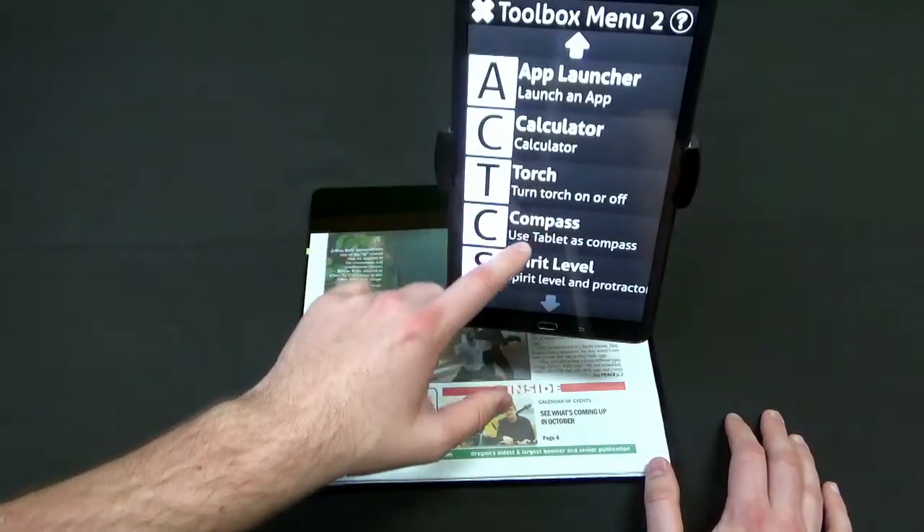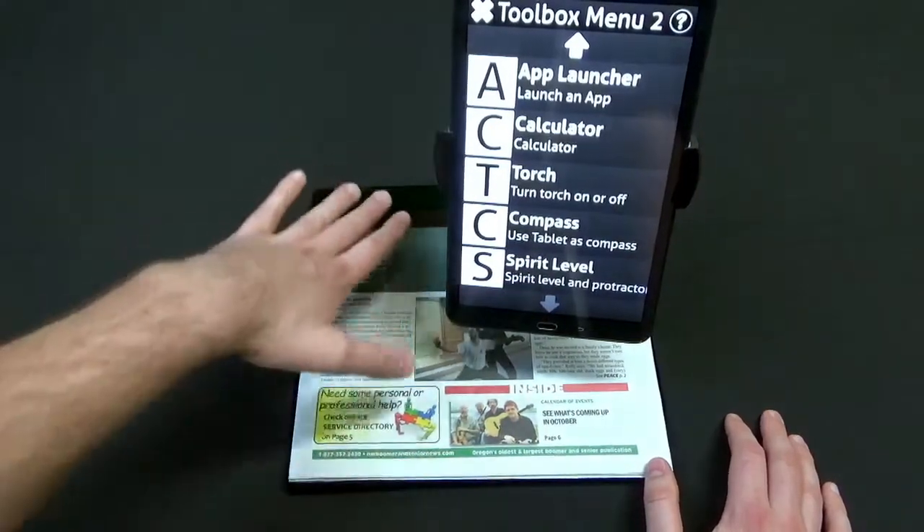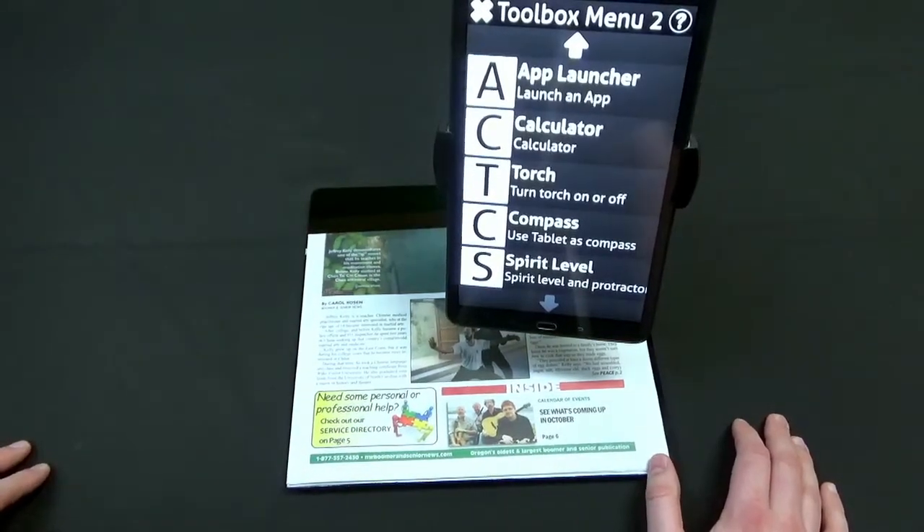The toolbox also has things like a flashlight, a calculator, a compass, and a little level. You can set your tablet on something and it will tell you if it's level — it's not the best level in the world, but it does the trick if you're in a pinch.